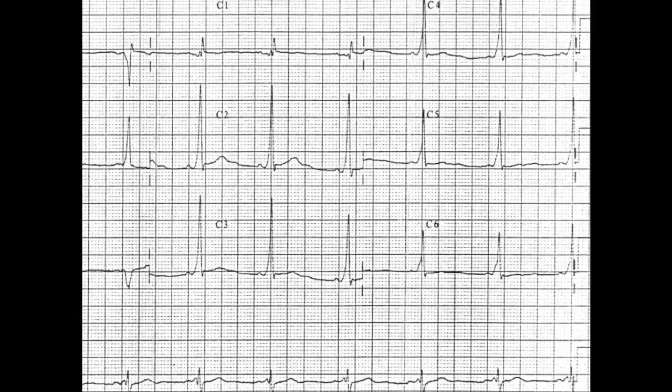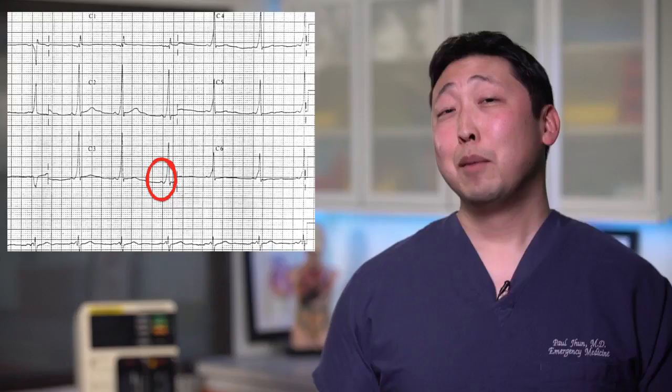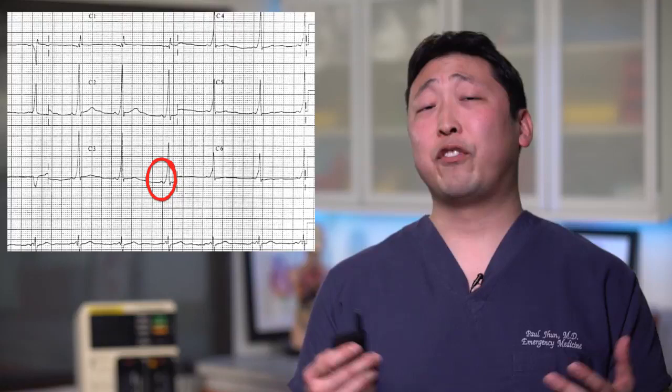Do you see the abnormality? Do you see the shortened PR interval and the slurring upstroke into the QRS complex? That's called the delta wave, and that is suggestive of Wolf-Parkinson-White syndrome or WPW syndrome. But besides that, there's a whole laundry list of red flags that we should be looking for on the ECG.